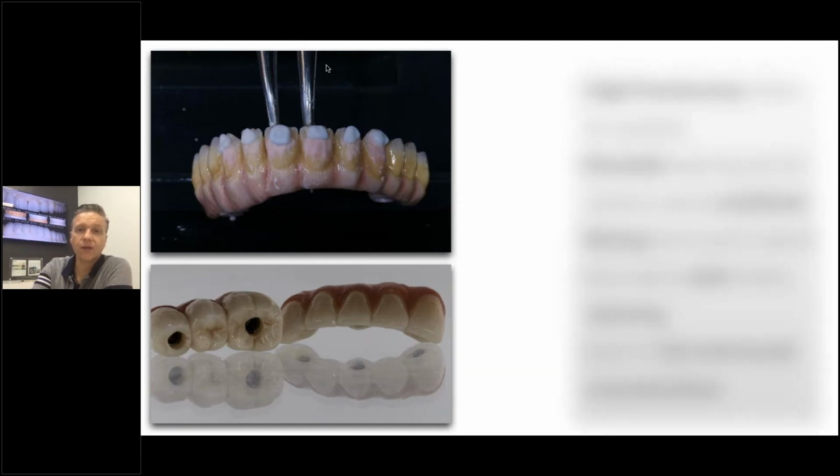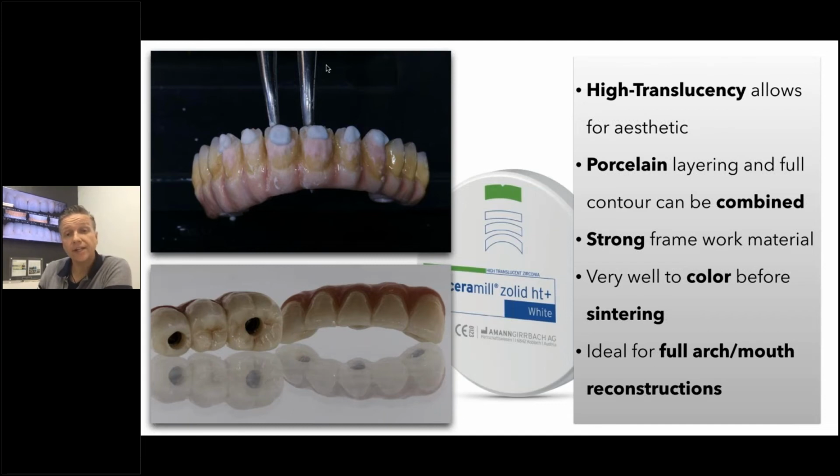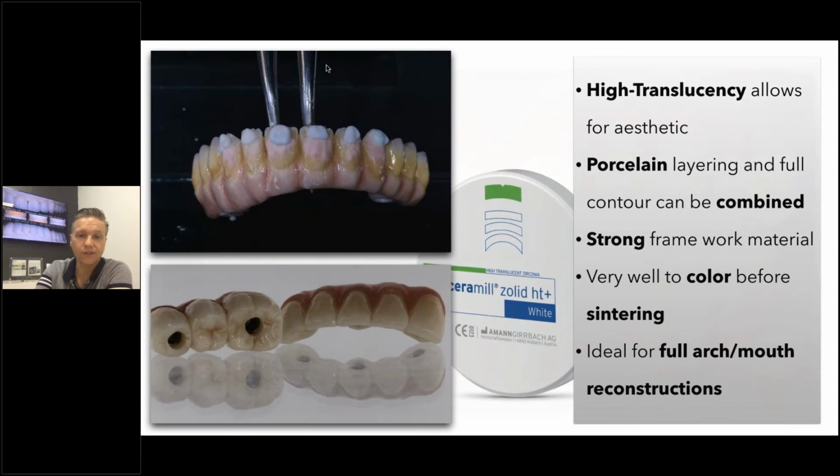By the way, just to go back quickly here, you see the blank blending in, and you see Zolid HT Plus white. The Zolid HT Plus is available in white or in pre-shaded blanks in all 16 Vita colors. For a full arch case, I usually mill in white because I want to customize the color. You have to imagine, if you nest this in your nesting software and have to tilt it a little bit to one side or the other, and you have a pre-shaded or multi-layered blank, it can affect your color. So I usually do white and hand color the case, just to get a more natural look. Here, the finished case, upper and lower zirconia hybrid.